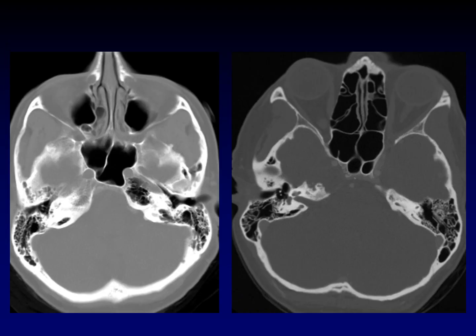In patients with asymmetric pneumatization of the petrous apex, the CT is a complete giveaway. This is normal bone marrow. This is normal air cells. This asymmetry is clear when you see it on CT. It's only confusing when you're looking at a T1-weighted MR image, when this asymmetry really pops out at you. So this is asymmetric pneumatization.